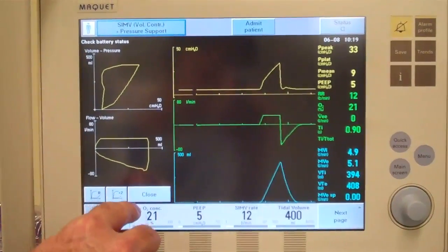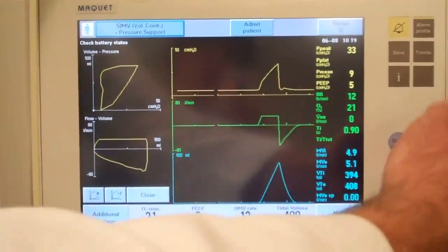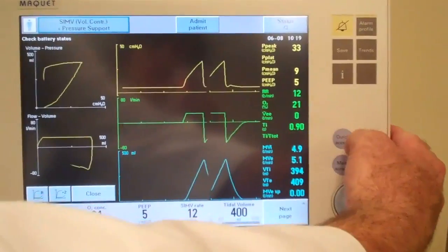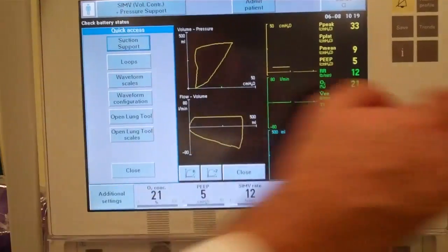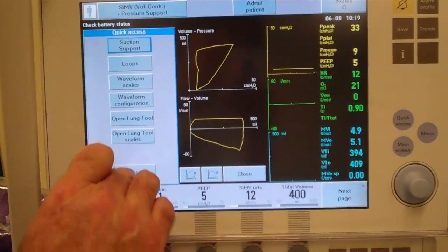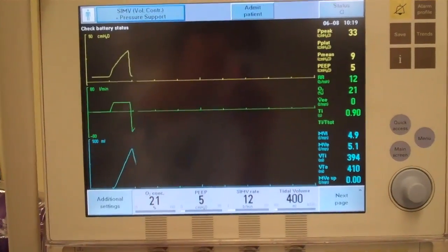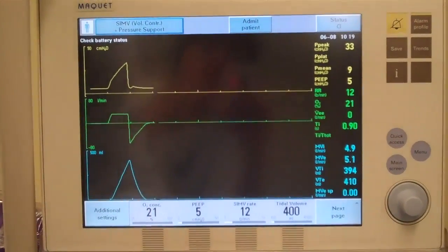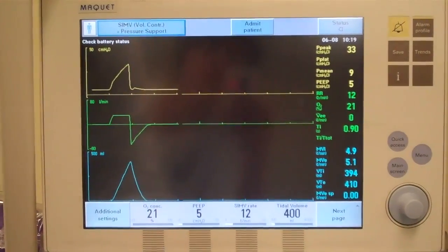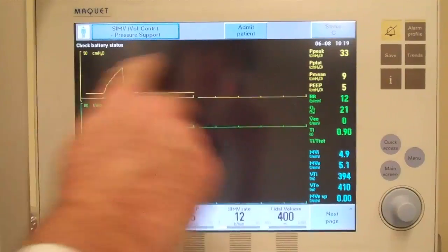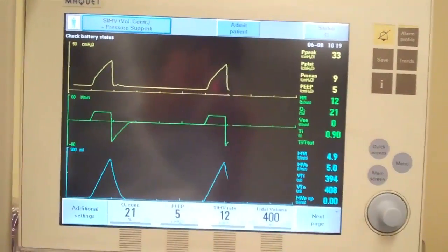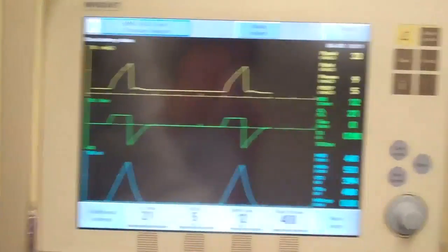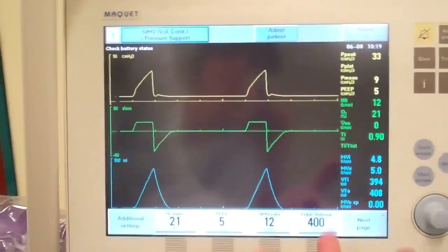I'm going to get out of the loop screen, and what we'll do now is do a manual pause during a positive pressure breath.